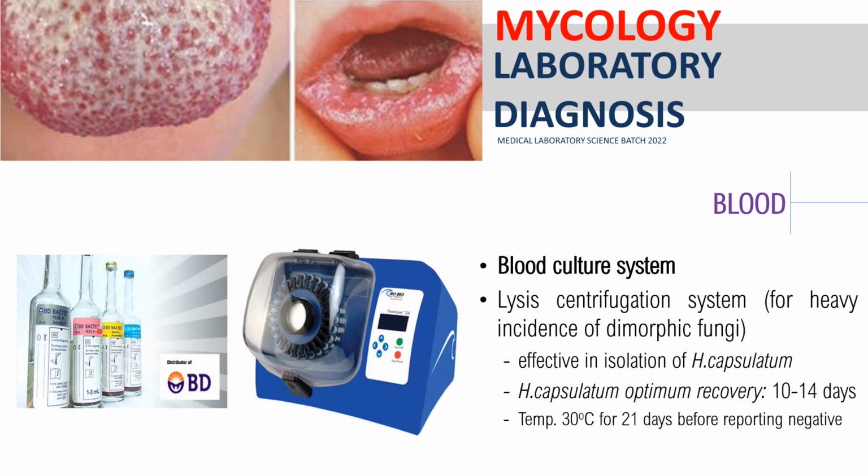So our next clinical sample class is blood. And what we usually do in microbiology class is that the sample blood, we use this one, diba, Bactec. And then we can actually identify this one using your blood culture system pagdating ng fungi. However, class, according to Baylis and Scott, for heavy incidence of dimorphic fungi, it is recommended to use your lysis centrifugation system. Your lysis centrifugation system, class, is still a blood culture system. Pero, sir, bakit kailangan natin gumamit ng lysis centrifugation system?